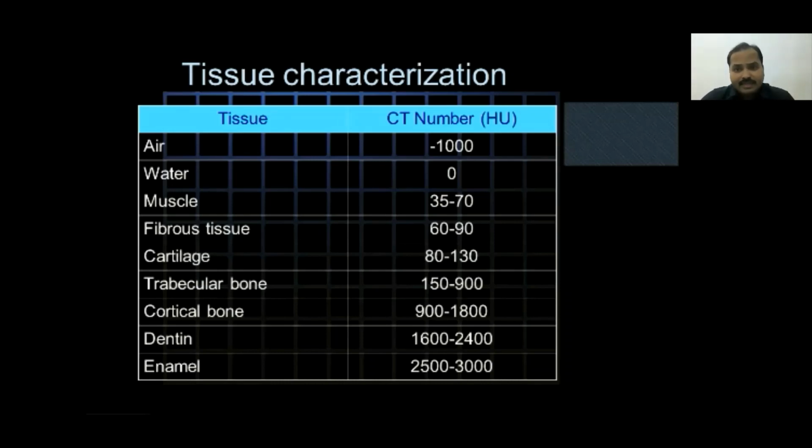These numbers designate the Hounsfield units, which tell us the density of that particular object in the image. Air will have a Hounsfield unit of -1000, which is less than water, which has been set as the standard Hounsfield unit of 0. Then positive Hounsfield units will increase as the density of the structure increases.